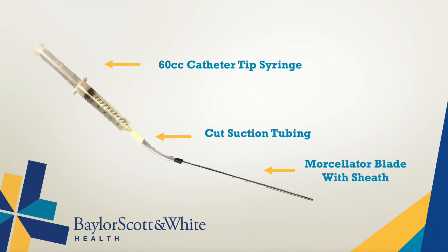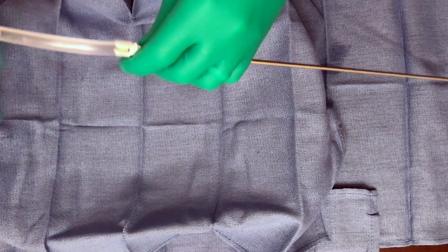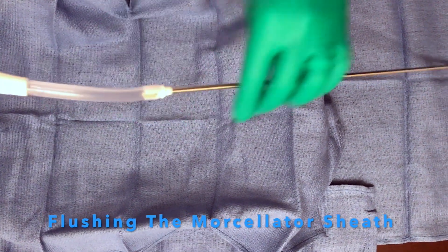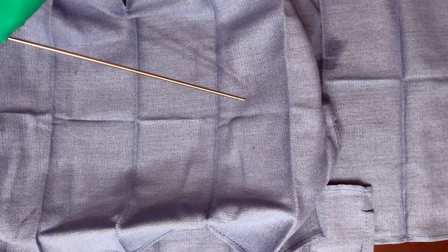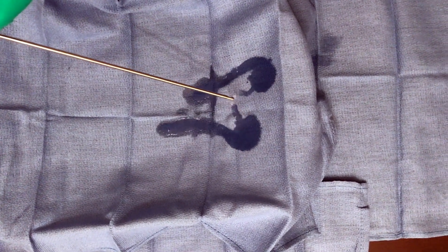We do this by removing the blade and sheath together from the handle and placing suction tubing over the proximal end to create a seal. We then use a catheter tip 60cc syringe to flush the clog out of the apparatus.